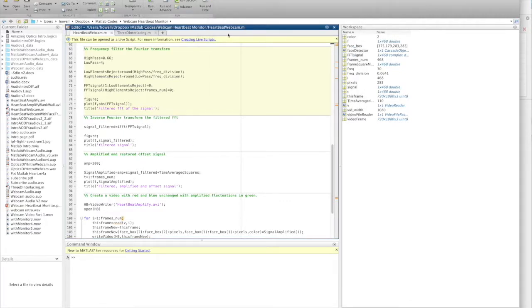In this section, we filter out some of the not so important frequencies of our signal. We do this by setting frequencies lower than 0.66 hertz and higher than 4 hertz to zero. This corresponds to a little less than 40 beats per minute and greater than 240 beats per minute. Let's run in advance.